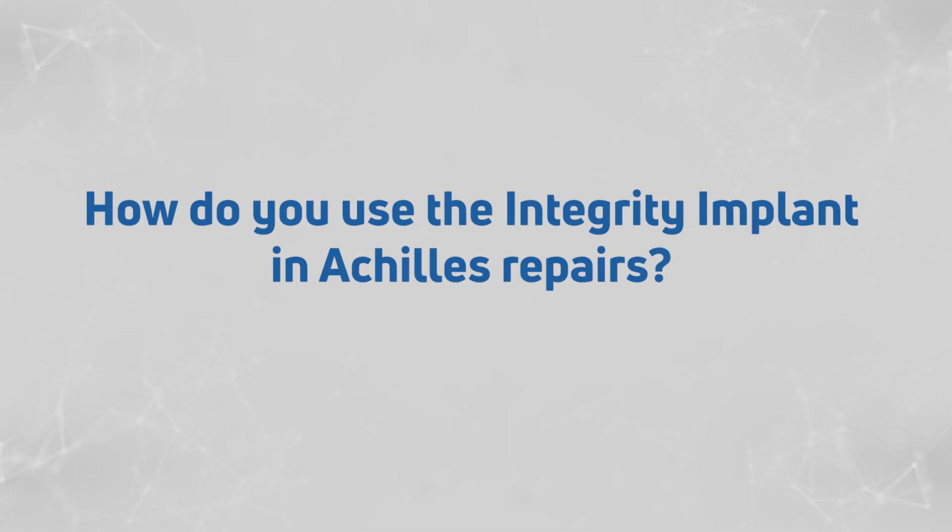With Achilles ruptures, I know a lot of the technique currently is using a lot of percutaneous approaches. Even then, with the onlay, you could slide this underneath the small incision and lay it over the sutures, hopefully, and that would be the goal, to try to use that to repair some Achilles tendon ruptures. I like sliding it behind the repair site, so it's not tension against the skin. But if I can push that underneath and decrease the edema in that repair site, that's important in my hands.